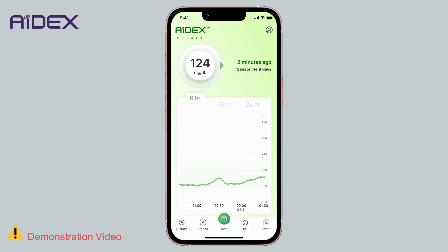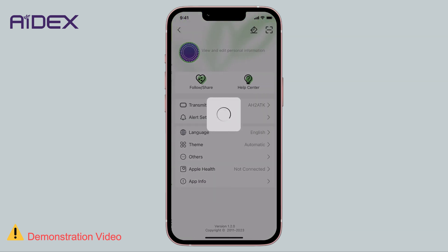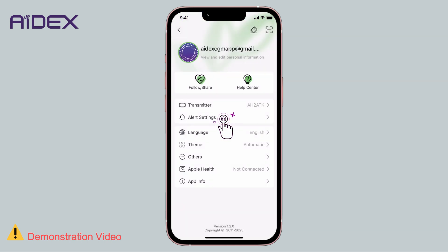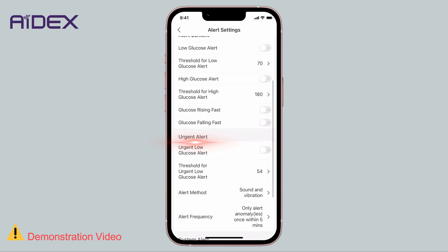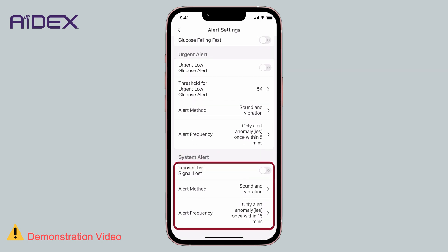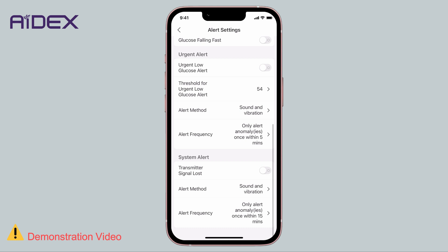As previously mentioned, we have the ability to define the desired target range and adjust its alerts. Tap on Personal Settings, then select Alert Settings. Here, we have three main types of alerts: Common Alerts, which refer to General Alerts; Urgent Low Blood Glucose Alert, triggered when blood sugar levels fall dangerously low; and System Alerts, which pertain to the system itself.